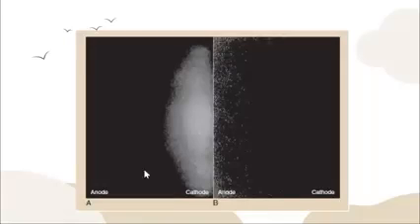So, ang nag-cause ani is anode heel effect. As you can remember, the intensity of the X-ray is more intense on the cathode side than on the anode side. Pag ani ang mag-occur, we can introduce a processor algorithm or manipulation such as flat fielding. So when flat fielding is applied, medyo uniform na siya compared ani. Although nagya po yung mga model diri, much better na siya kaysa sa kanina na image. Okay, it's called flat fielding.